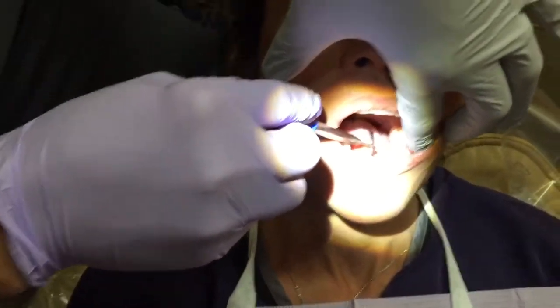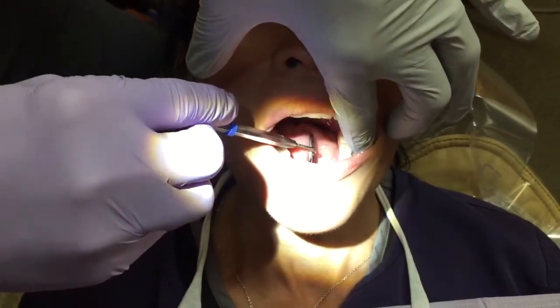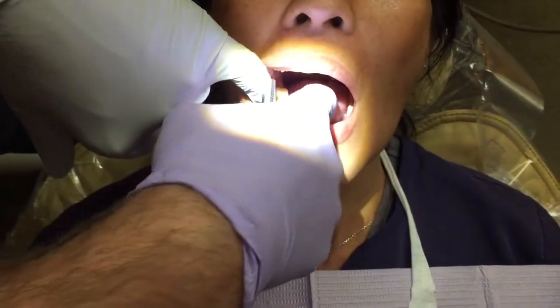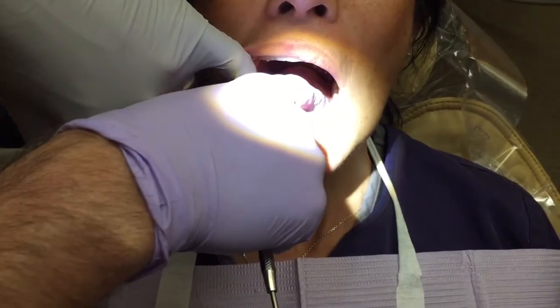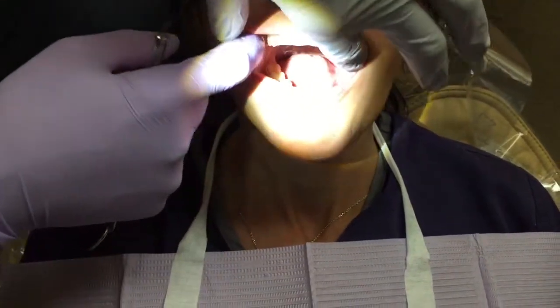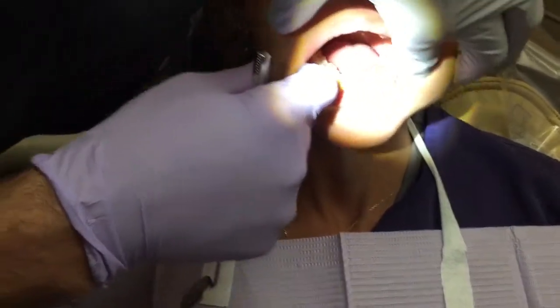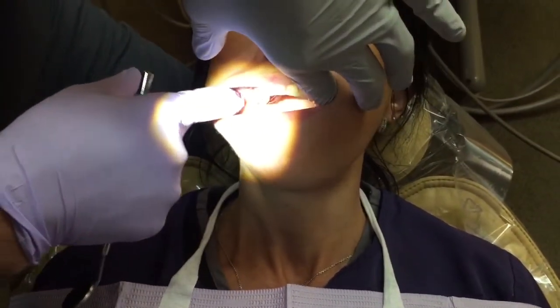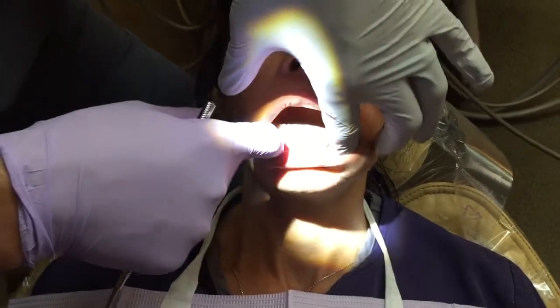I also put my mirror down to look at the floor of the mouth on both sides. Some dentists put their finger down there to feel for bumps — I'll do that if I can't see clearly. Then I lean to the side a little and look further back to make sure I haven't missed anything.